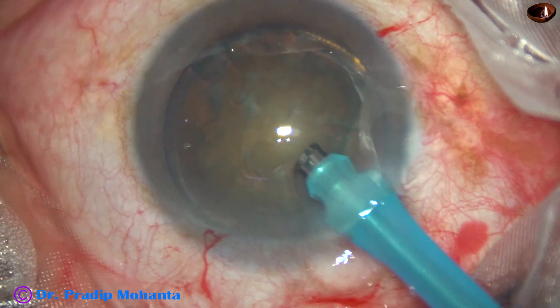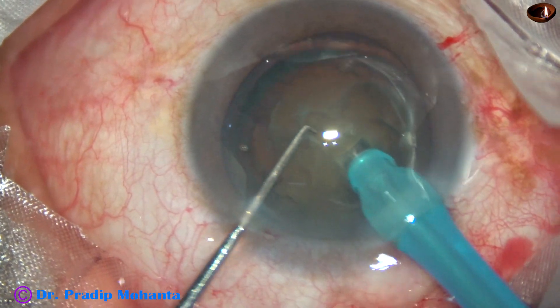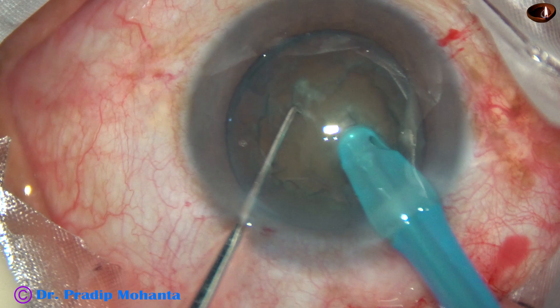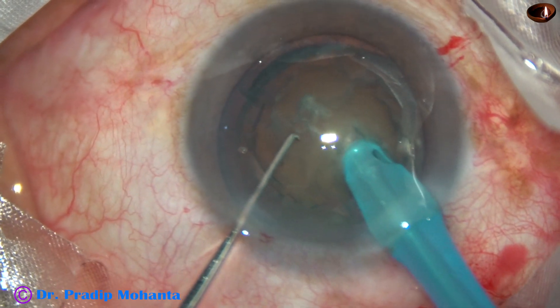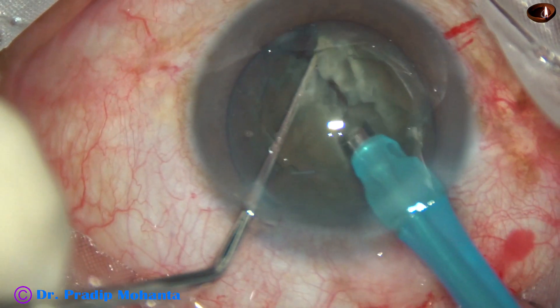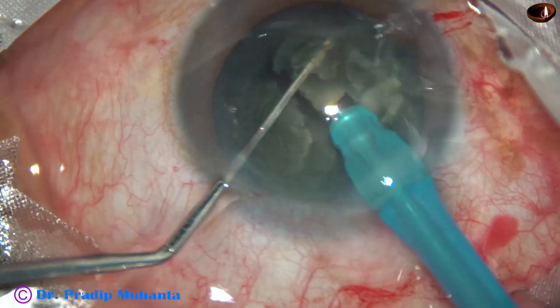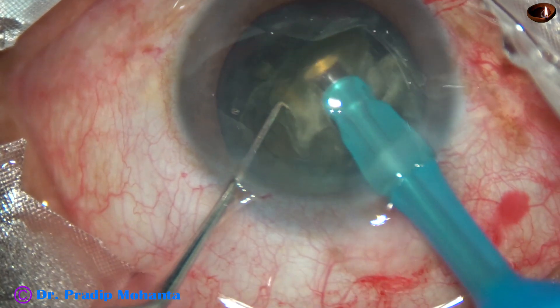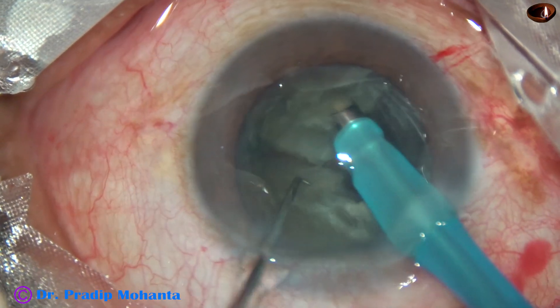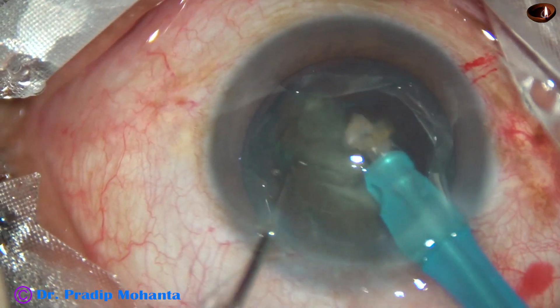In this video, I want to emphasize the importance of holding the nucleus firmly before attempting direct chop. You must hold the nucleus very firmly and test that it is not moving at all. In this grade 3 nuclear sclerosis, you can hold the nucleus right at the center very firmly and chop it. If the cataract is of medium density, you can emulsify the free nuclear fragments as you chop, as you make them free from the main mass.